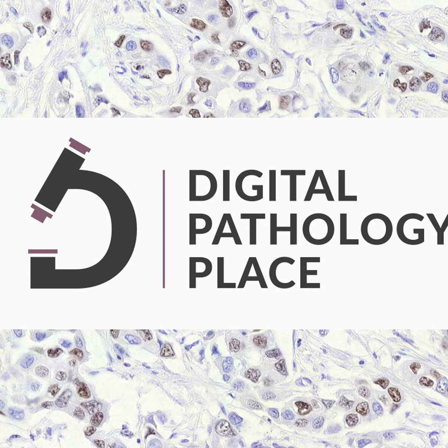Whereas in pathology, image quality is pushing the limits of scanning technology and display technology, and there's a lack of familiarity with what's safe. They are waiting for evidence. So when a vendor goes to them with a scanning solution, they have to be able to display it, and they have to show clinical evidence as well as technical data that the images as seen on the screen and read by the pathologist are equivalent, in the conclusions drawn, to looking at the same tissue slide on an optical microscope. And so that proof has to be provided. When the vendor provides proof of equivalence, then they will chill out. And that's happening with the Leica and Paige viewers.